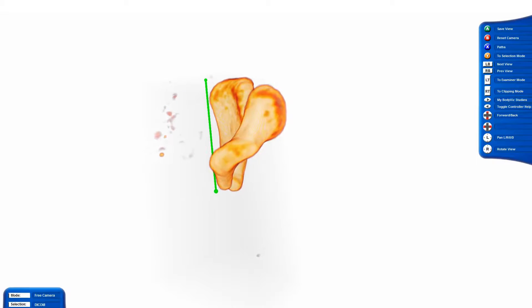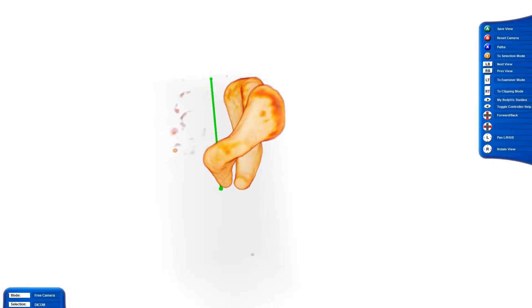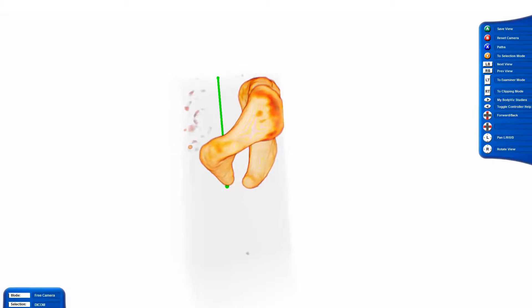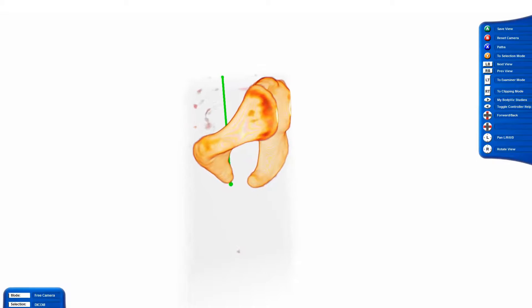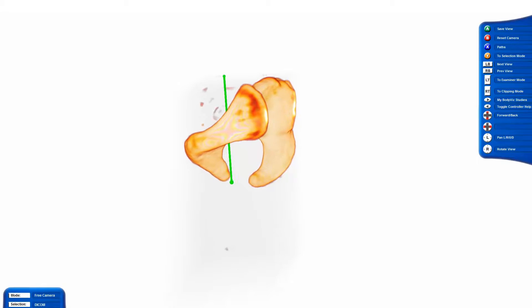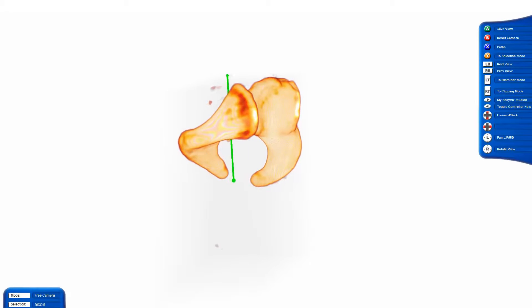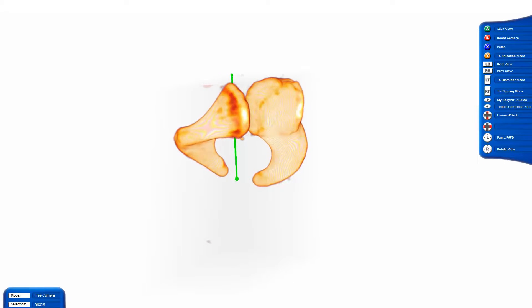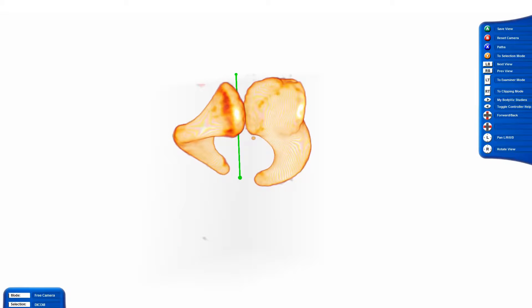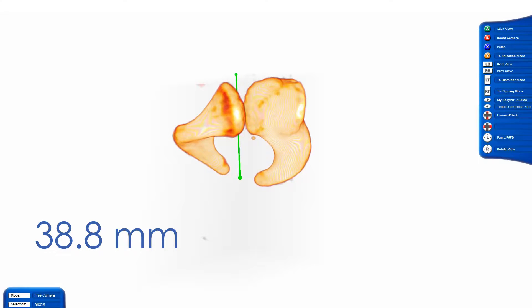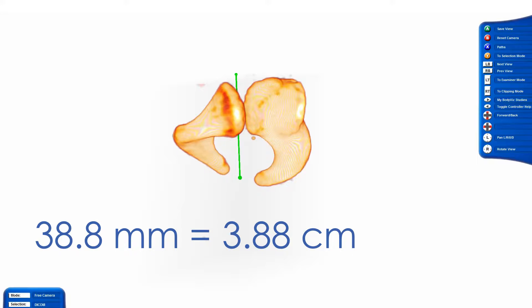While I'm panning around, notice that the green measurement that I've created is constant in relation to the volume. Like you saw in the image, the line segment is 38.8 millimeters long, which is 3.88 centimeters or about 1 inch.